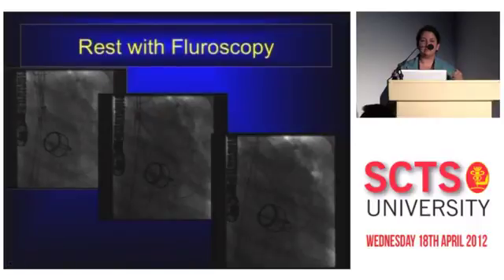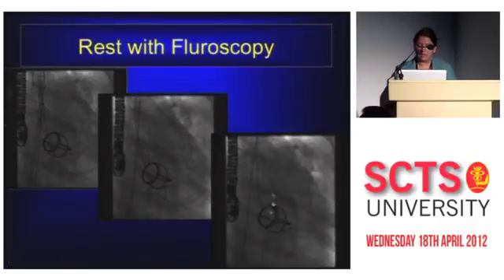Once it anchors against the annulus, you're committed, and you hit a point of no return where even if you tell your interventional colleagues that it's not looking pretty, they're committed to delivering the system, and they may have to do post-procedural things like putting another valve in valve or post-dilatation, but there is a point of no return beyond about the first third of the valve. So it's fluoroscopy-led, and more of the CoreValve is let out of the delivery system until finally you have the end result there. That, incidentally, is a Starr-Edwards valve.